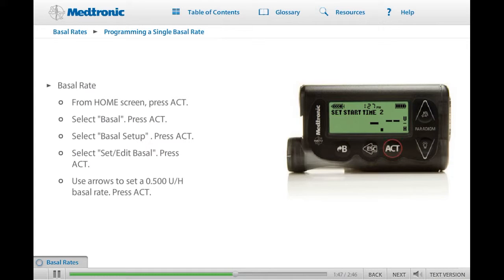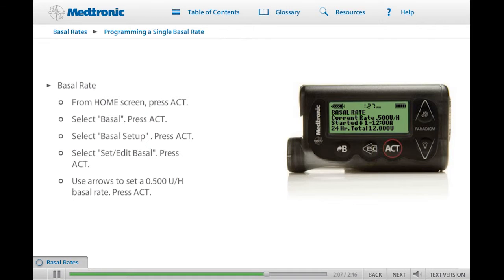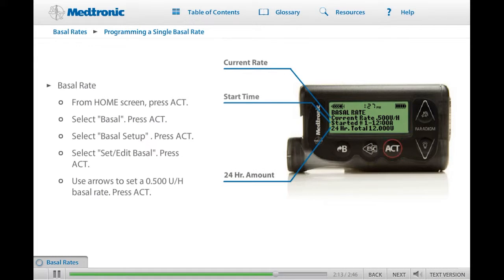When you press ACT, the Set Start Time 2 screen appears. If you were programming more than one basal rate, you would use this screen to set the time and rate for your second basal rate. In this exercise, we are only programming one rate, so to complete the programming of this single basal rate, press ACT. The basal rate screen appears, showing the current rate, the start time of that rate, and the 24-hour total amount. If you set your basal rate at 0.500 units an hour, you will receive a total of 12 units of insulin over a 24-hour period. Your daily basal rate is now programmed.